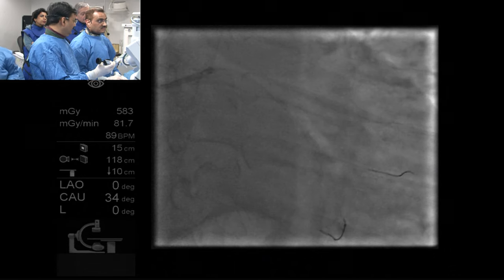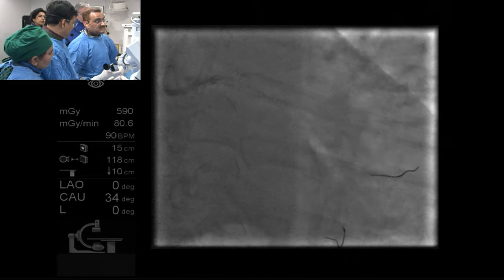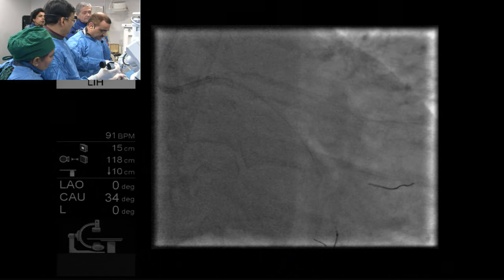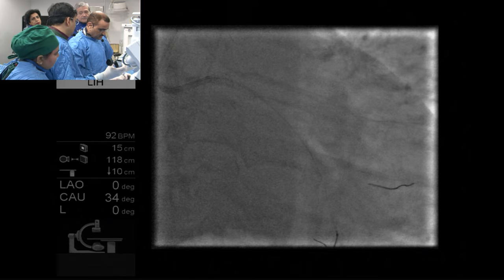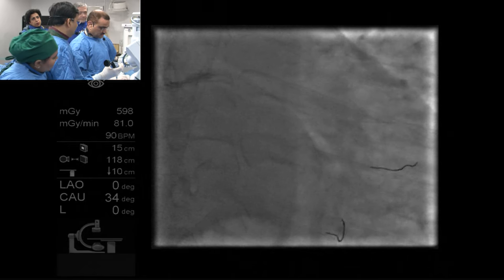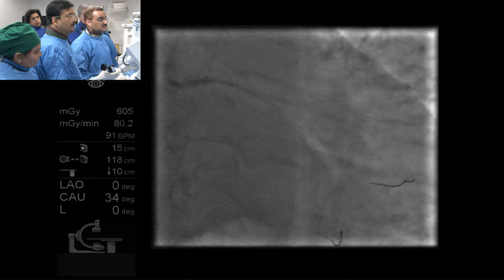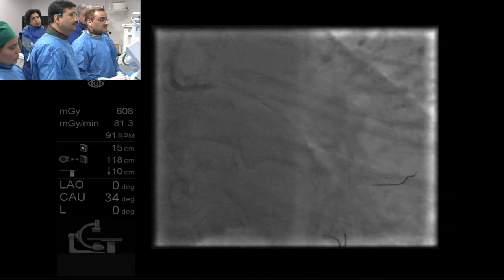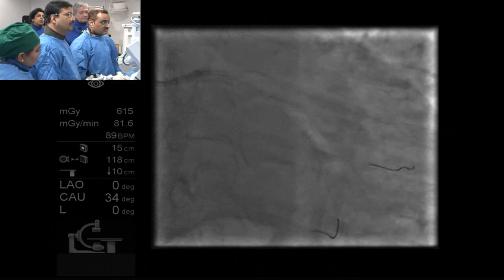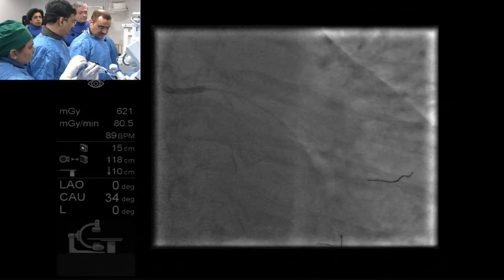No, that's a lot of resistance. Yeah, I think there's crisscrossing of the wire. No, it cannot be, because I had separated those wires. Yeah, it still does it, you know. And the catheter, we use that. I know, it should go. You can remove the balloon and then put the stent and then re-enter with the balloon. No, Samir, it won't happen that way. Once you go with the balloon distally, it should go, because this is monorail. Let me just try one more thing.